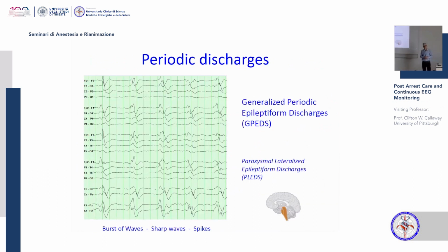Ooh, discharges. Remember, there were bursts, and then short things were discharges. So discharges kind of look like epilepsy. They're sharper, and you have waves, which you can see there, almost look like EKG artifact or EKG QRS complexes in your brain. Well, I told you want your brain as an electrical organ to be doing different things in all the different parts. Your heart, you want to all be synchronized so that it makes muscular activity and it works synchronously. So your brain should always be something like fibrillation. Your heart should always be synchronized. When you get those things mixed up, it is bad news.